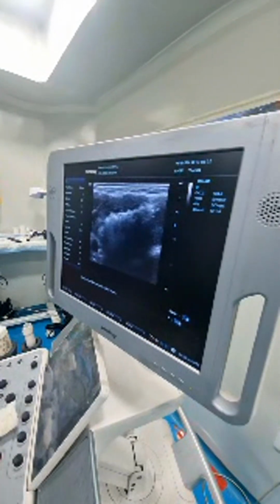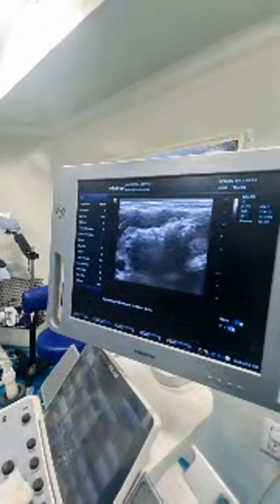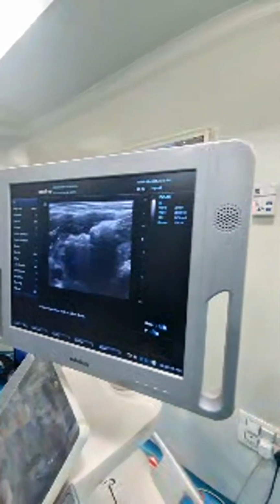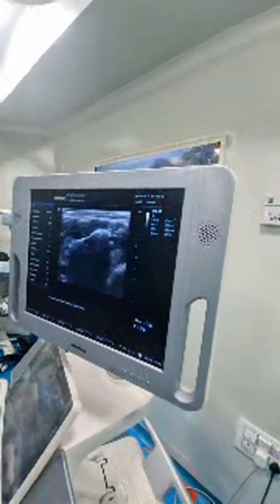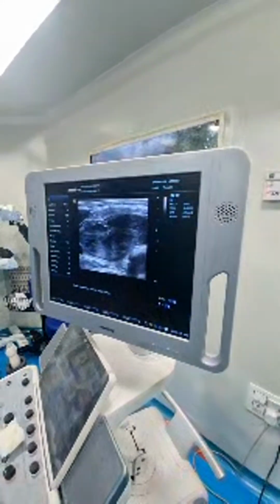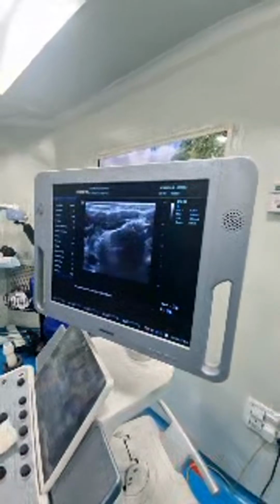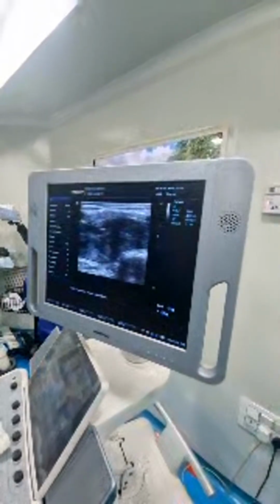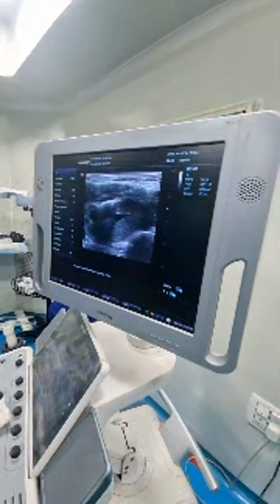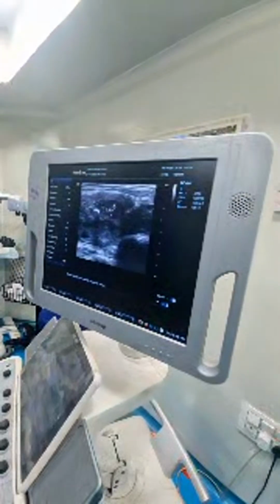Can you see that I am moving with every beep, such that that particular portion of tissue, we want it to get ablated. You see that? Yeah. So now I'll go a little up under the guidance. It is like a fan beam. We have to choose the areas.